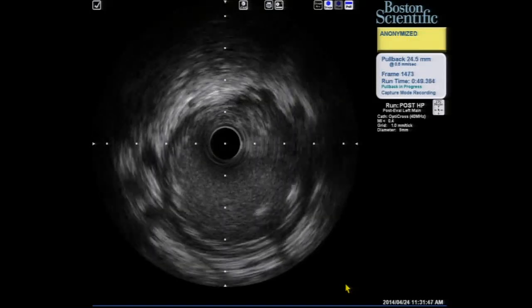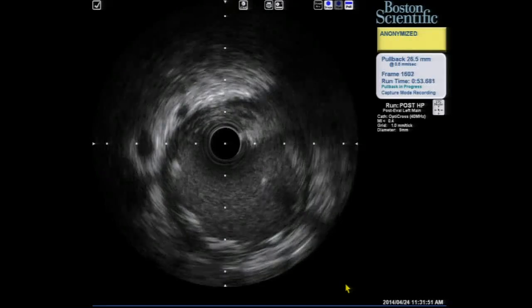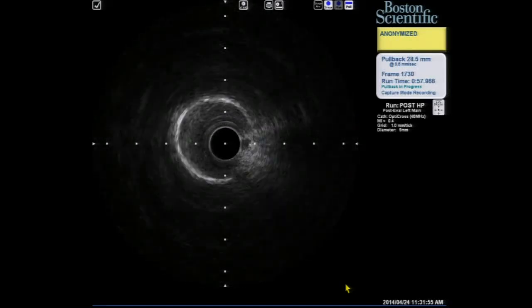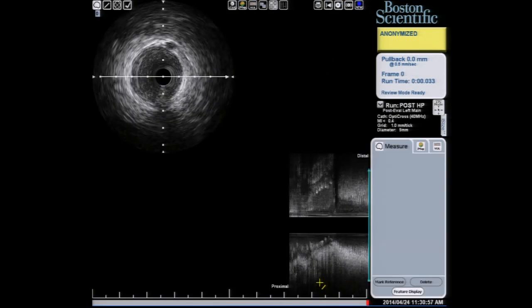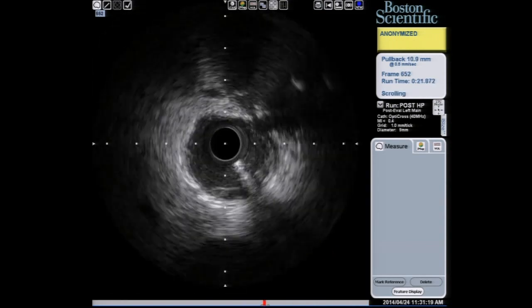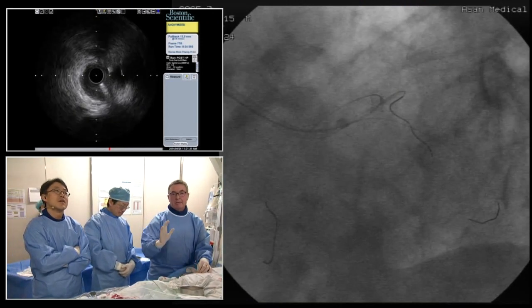Well, it's two questions. First of all, you noticed on the IVUS that the diagonal was intact and looked pretty good. Yes, so we'd be creating a problem. I completely agree, Ian. The diagonal looked fine, and what I like about that is that it's reassuring for me to know that there's literally no plaque in that diagonal. The ostium looks fine. It's a relatively oval-shaped ostium, which is typical. Having said that, Marty, I would do nothing.